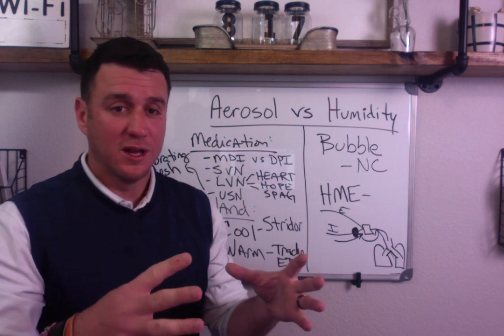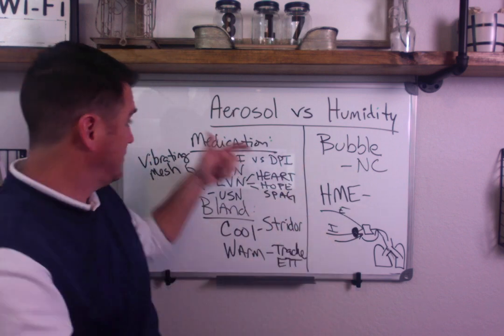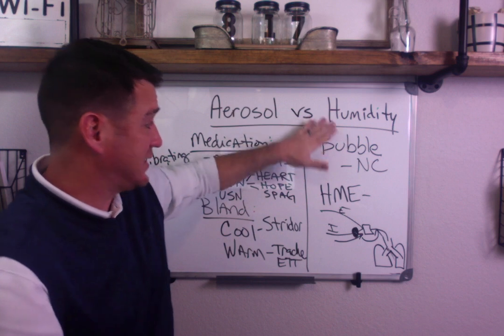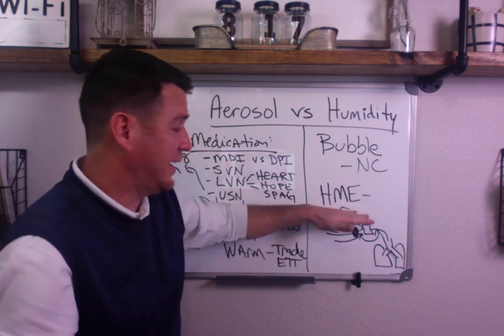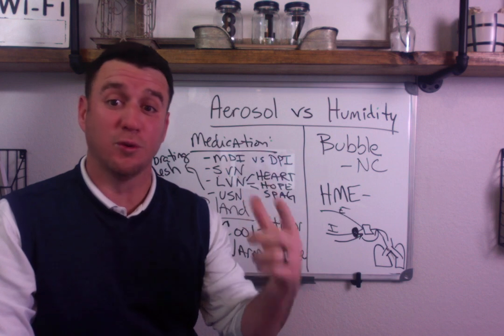Okay, so this is a quick breakdown over the macro level of aerosol devices that deliver medication, aerosol devices that deliver bland aerosol, and humidity devices that will help to improve humidity based off of nasal cannula device versus also HMEs and your Passover devices, including your wicks.